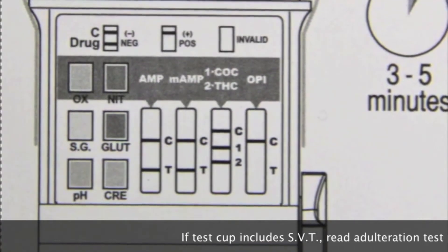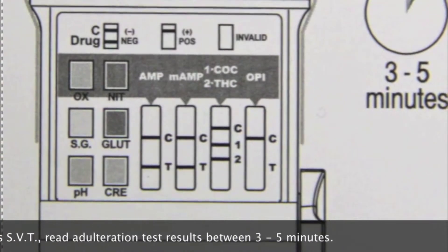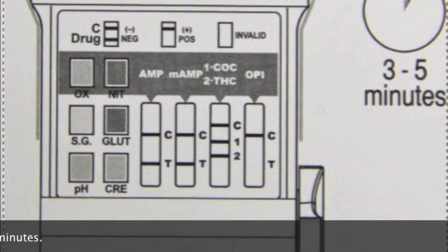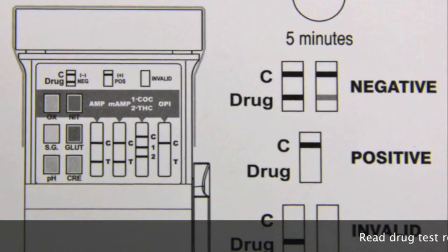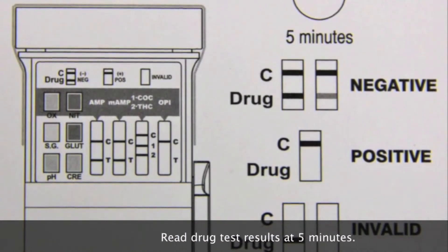If the test cup includes an SVT, you can read the adulteration test results between 3 to 5 minutes. Otherwise, you'll have to wait 5 minutes before you can read the drug testing results.